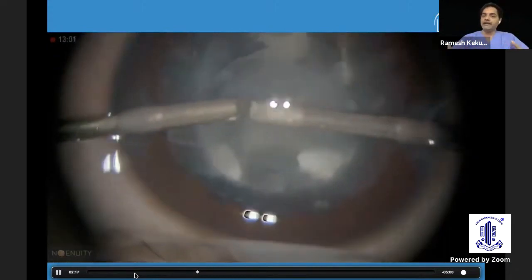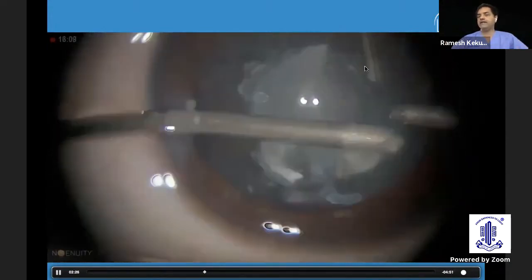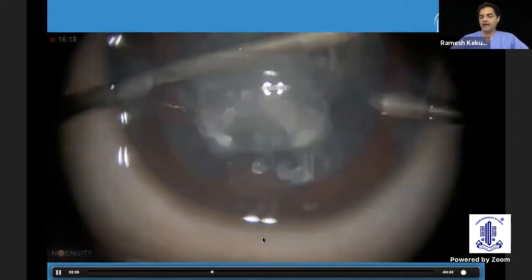The next step, whether you have to do a hydrodissection or delineation, generally it is not required, and in a total cataract, better to avoid, because in case there is a dehiscence of the posterior capsule, your nucleus might go. In this case, you can see when I'm trying to do aspiration, this kind of pearl calcified material is there. So you need to be prepared anytime to change it to phaco aspiration. In 10% of the children, the nucleus is so thick that they won't even come. So you can see that central part is very thick.